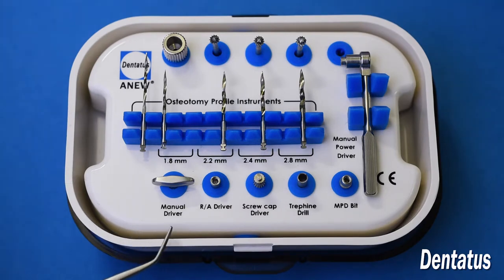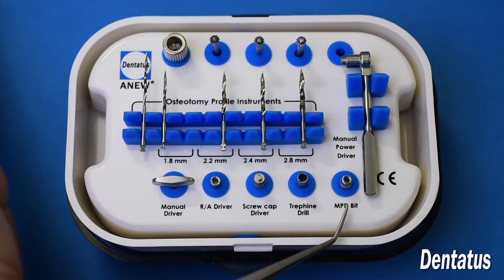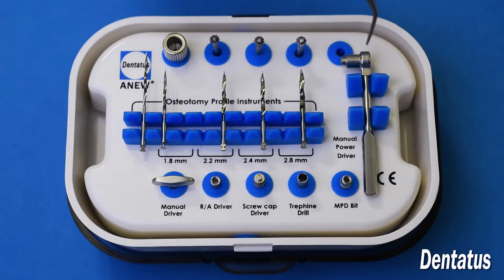The manual driver is used for implant insertion. There's also a right angle driver if you prefer to use the handpiece. Here's your screw cap driver for removing your temporary crowns after they're integrated. You have a Trephene drill and your MPD bit, which is used in conjunction with the ratchet.